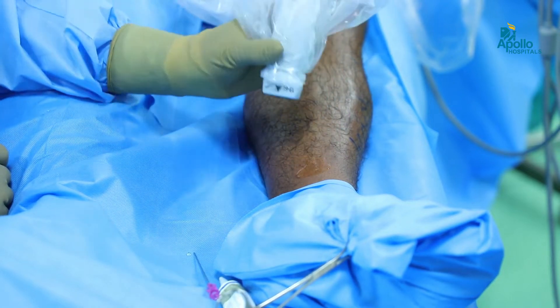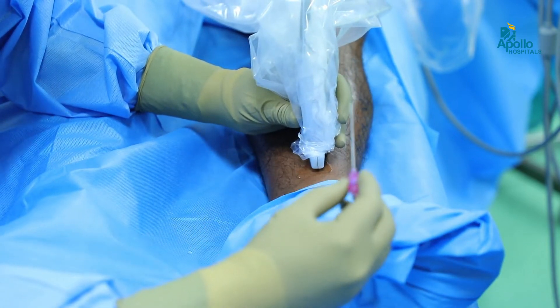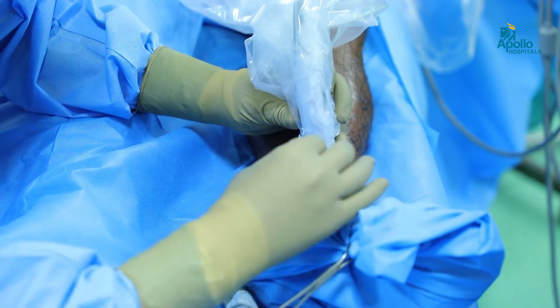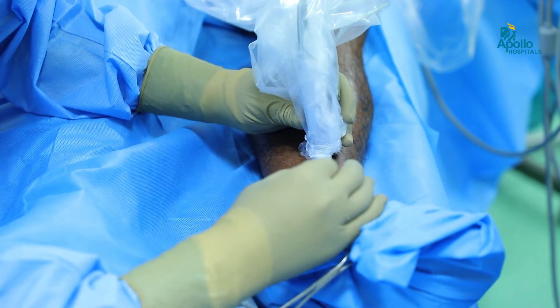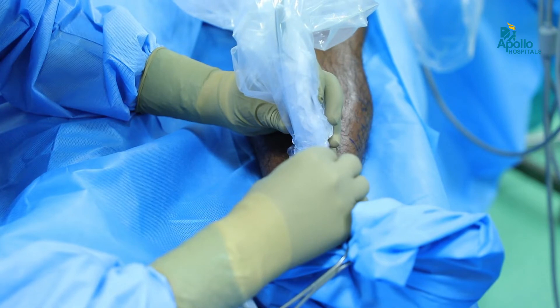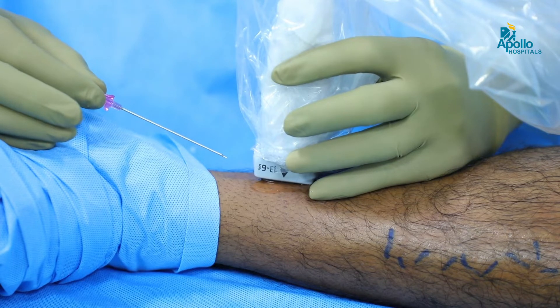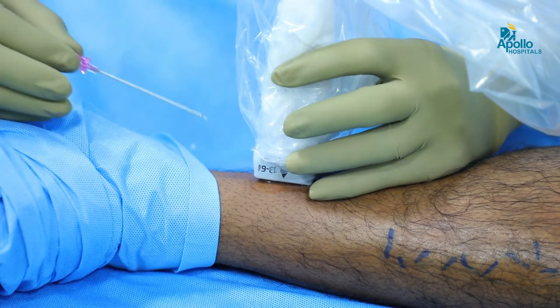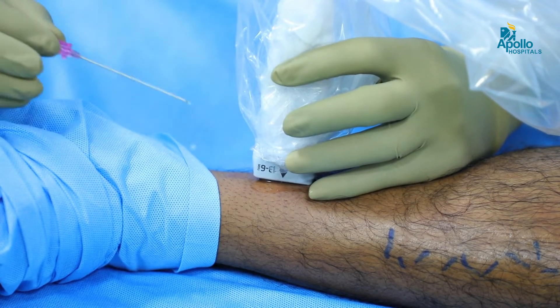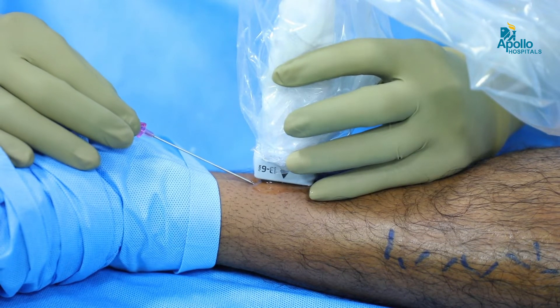Under ultrasound guidance we gain access to the great saphenous vein. This is how we place an introducer sheath to the great saphenous vein — under ultrasound guidance we put a small needle inside the vein. This procedure, EVLT, is done under local anesthesia as a daycare procedure. We gain access to the great saphenous vein through a small needle using ultrasound guidance.